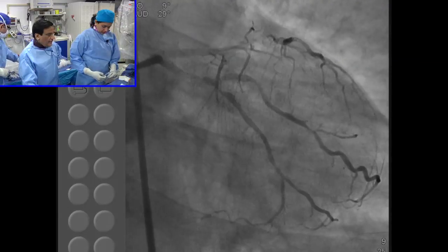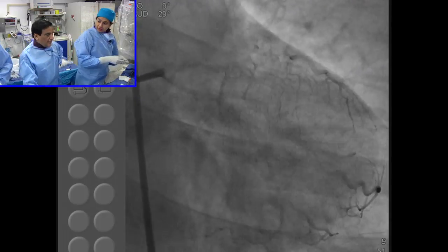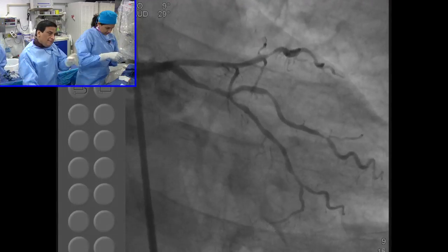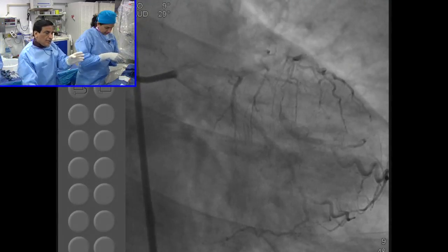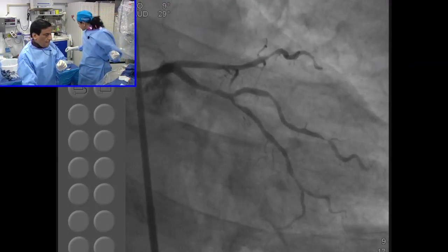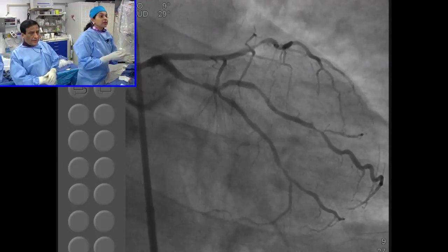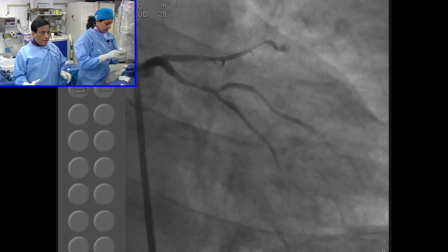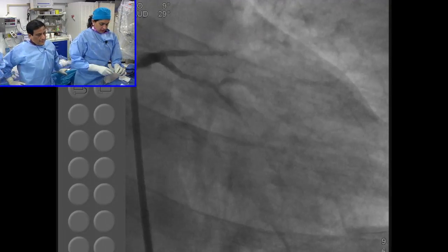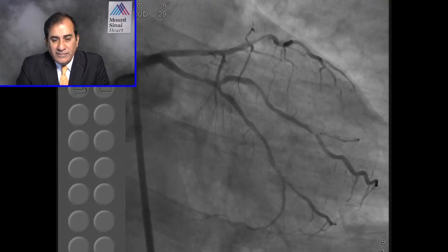Absolutely. And now we actually have the data to support that not every case the 2 stent is bad, and also not every case needs the 2 stent. Now, in the simple group, when they compared the 2 stent versus 1 stent, actually there was slight harm of the 2 stent strategy, which I did not show because that was not statistically significant. But clearly the trend was that once you have a complex and you do 1 stent, you actually have more trouble.